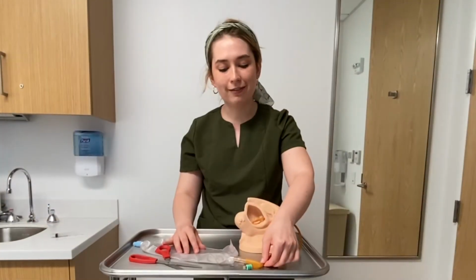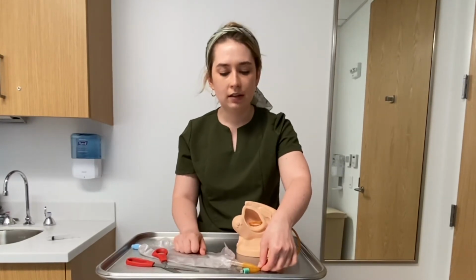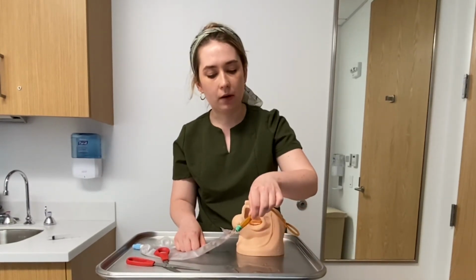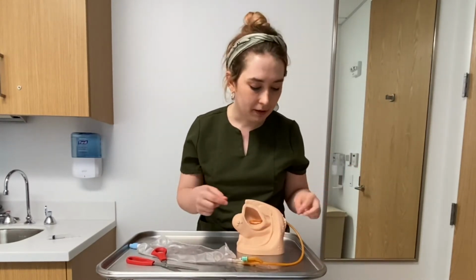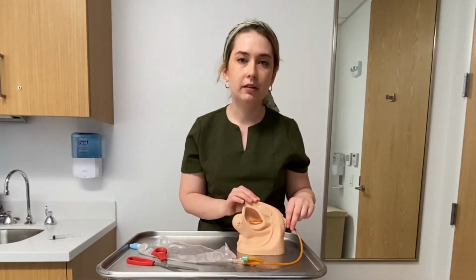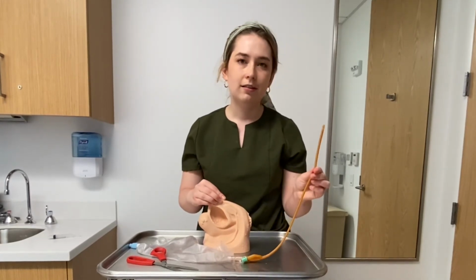Just make sure you give it enough time for all of the fluid to come out, and you will notice that it's going to stop dripping at one point. Make sure you're doing this over a sink or with a towel in place. Once you notice the fluid is done leaking, slowly take the catheter out, and you're done.